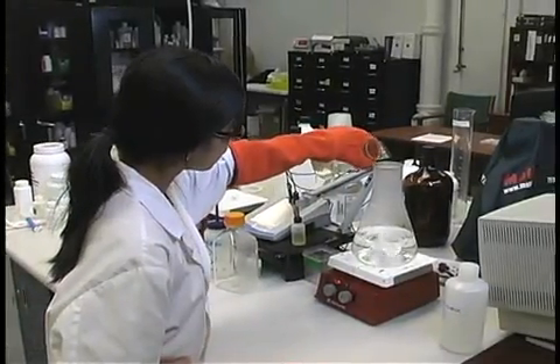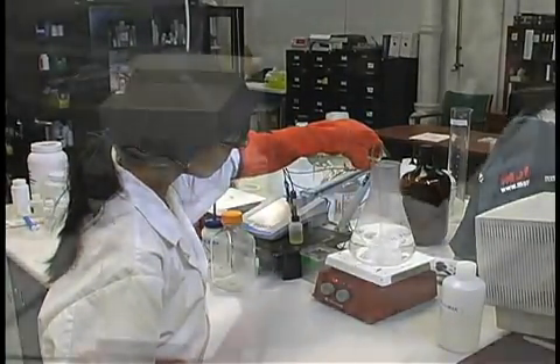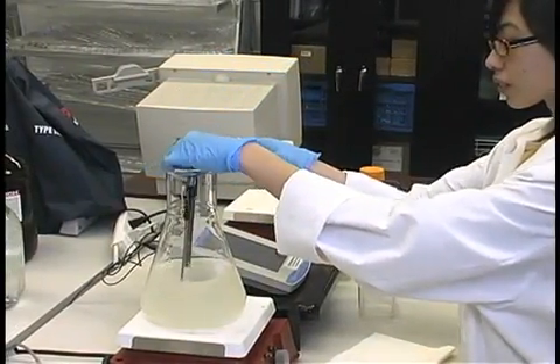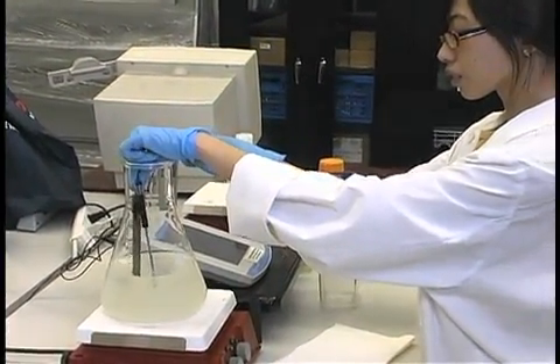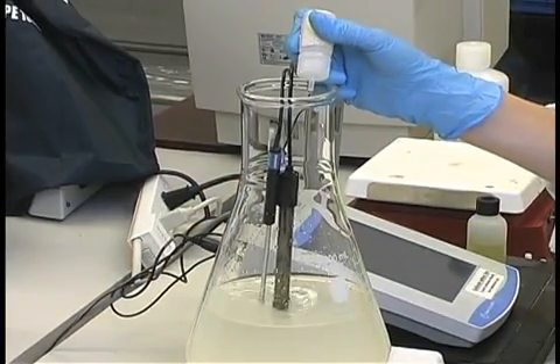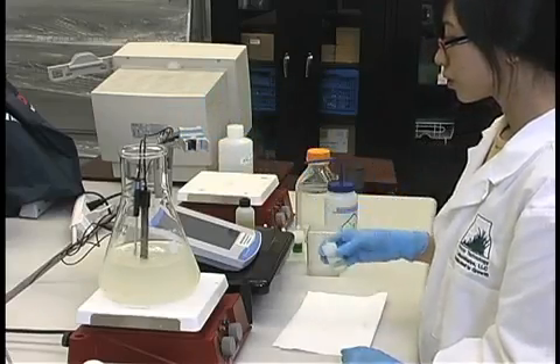Add the additional tissue culture grade water to bring the medium to the final volume. While stirring, adjust the medium to the desired pH using sodium hydroxide, potassium hydroxide, or hydrochloric acid. It is important to always adjust the pH of your medium after all components, including gelling agents, have been added.